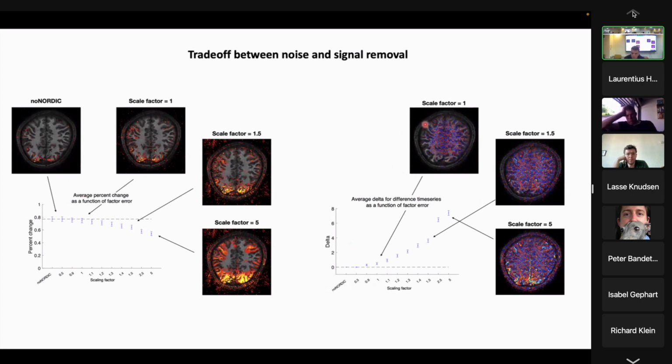And then we do see here that for the default case, it just looks like random noise as we want it to, but we can see that when we average across all the voxels, there is some signal in this activation map of the difference. So we do remove some signal already here.